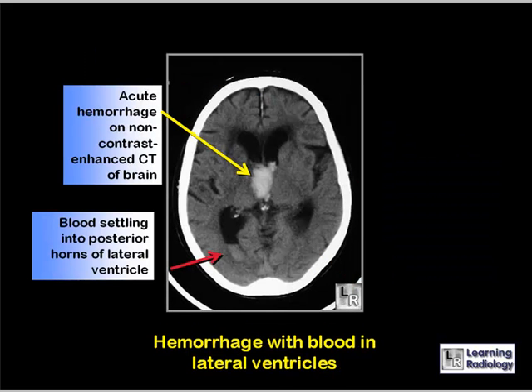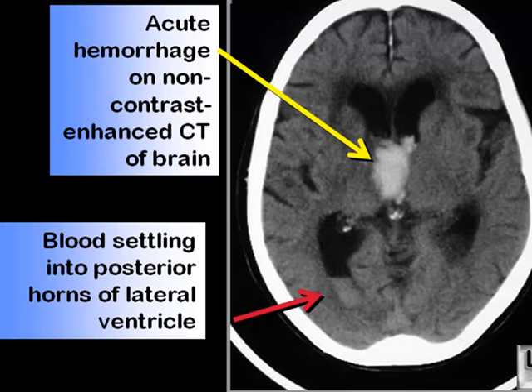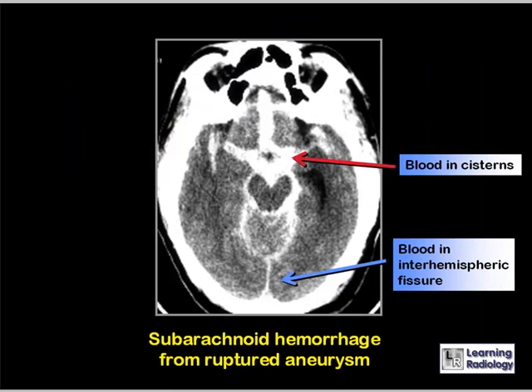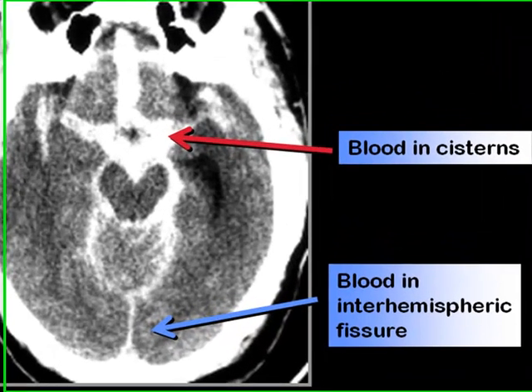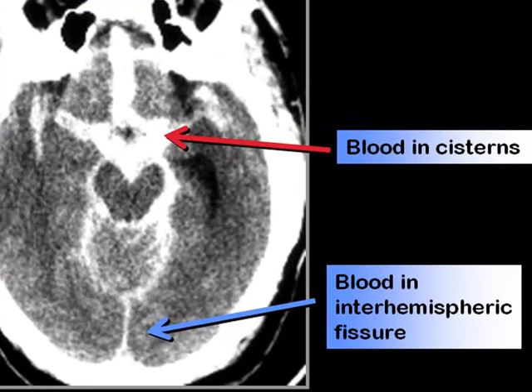This is an example of hemorrhage with blood in the lateral ventricles. The yellow arrow points to acute hemorrhage on non-contrast CT, and the red arrow shows blood settled into the posterior aspect of the occipital horns of the lateral ventricles. This is an example of subarachnoid hemorrhage from a ruptured cerebral aneurysm — the red arrow points to blood in the cisterns, the blue arrow to blood in the interhemispheric fissure. Blood in the cisterns, fissures, and sulci should make you think of subarachnoid hemorrhage.